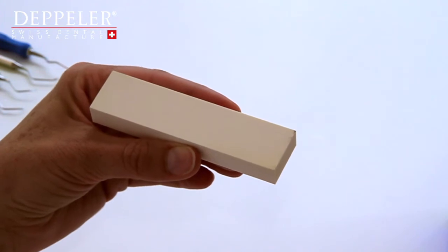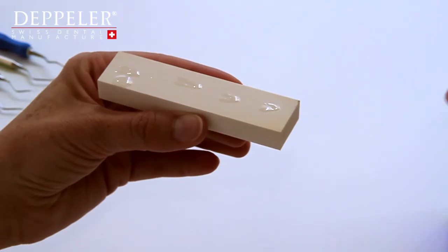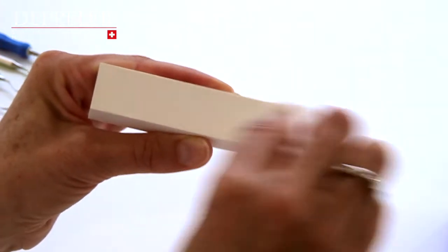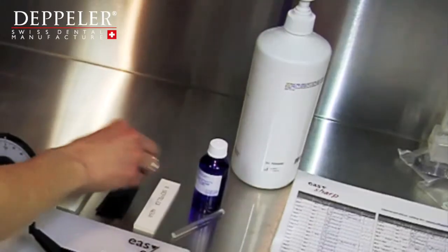Start by putting a few drops of oil onto your stone and spread it around using a clean cloth. This simple gesture will guarantee an optimal surface condition for your blades. For angles close to zero, add a spacer to raise the stone.